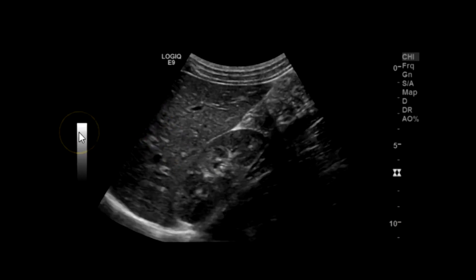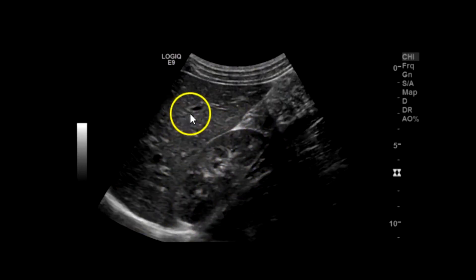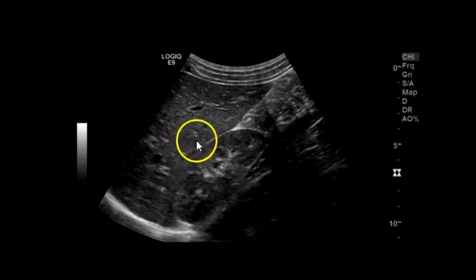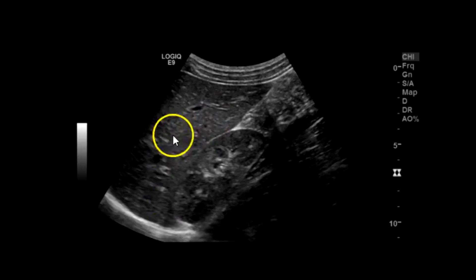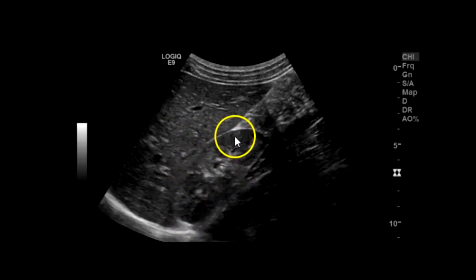Around the mid-axillary line level you get a nice portion of right lobe of the liver and your right kidney. The liver is usually supposed to be hyperechoic, or sometimes isoechoic, to the right kidney — but it's usually slightly hyperechoic. If it's very, very hyperechoic, the patient can be having a fatty liver. If the kidney is hyperechoic to the liver, then you have to consider some type of renal failure or medical renal disease.